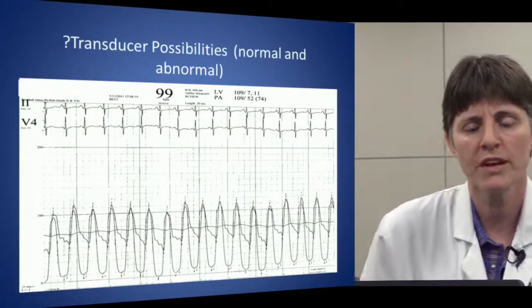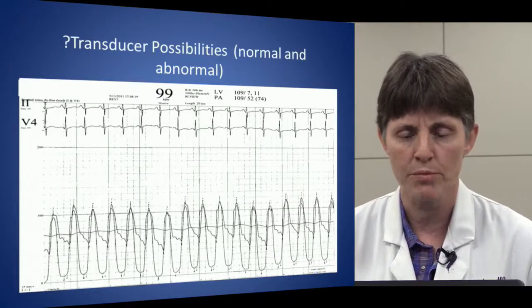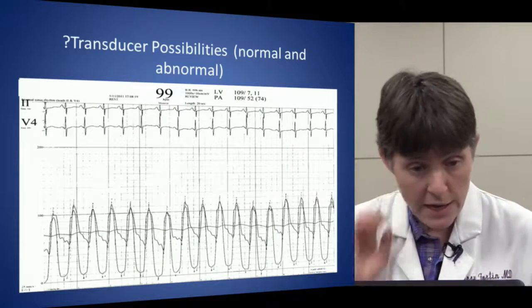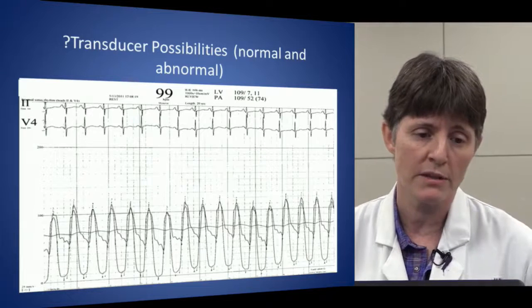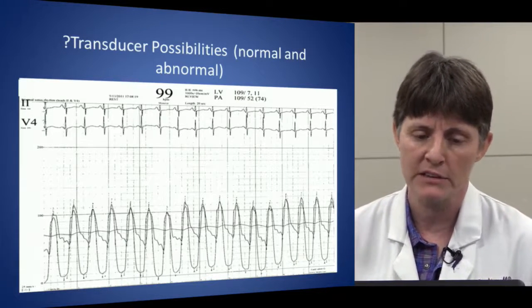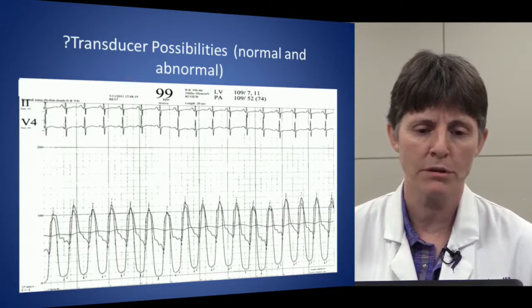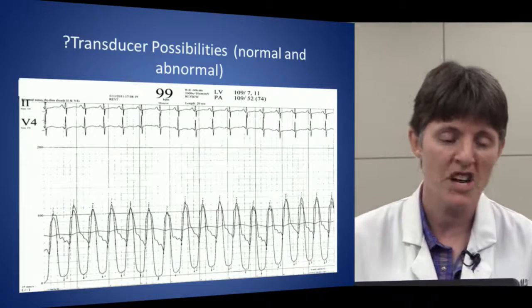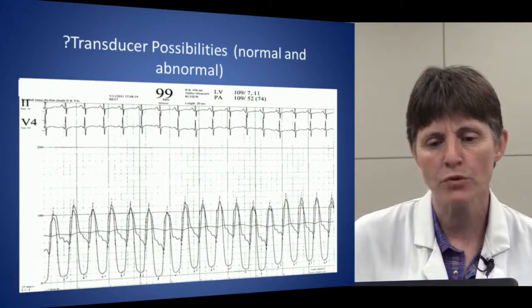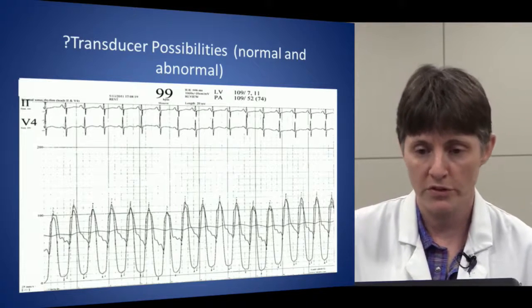If we put those two things together, and we have a ventricular tracing and a PA tracing both being measured at the same time, you'll see that the PA systolic pressure or the aortic systolic pressure and the ventricular systolic pressure are the same, but diastole is different. And again, that's the elasticity of the vessel. This means that there's no valvular problem between those two chambers, if you want to call them. So the ventricular systolic pressure is equal to the great vessel systolic pressure.